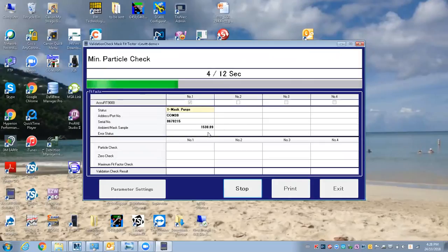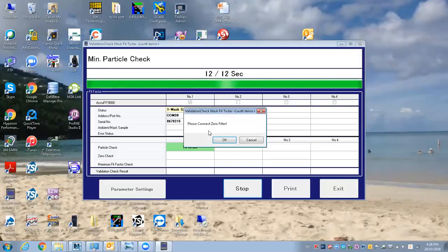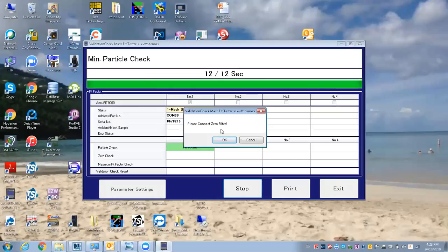Let's just try and see if we have enough background particles. I can already tell I only need about 1,000, so I've got enough. Some are set to a minimum of 2,000 just to make sure you have enough. It checked—there's enough particles in there to do the fit testing.